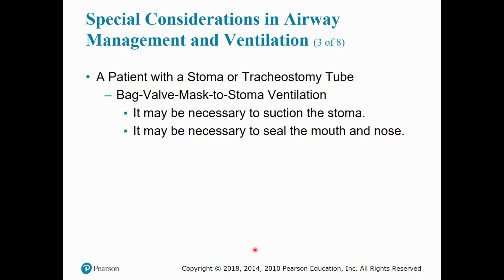Now, at times it may be necessary to suction the stoma. If needing to suction the stoma, first you need to make sure that all coverings have been removed, because they may have scarves or ties or something to cover the area where the stoma is located. Clear the stoma of any foreign matter that's around the area. All you have to do is just suction around the stoma.